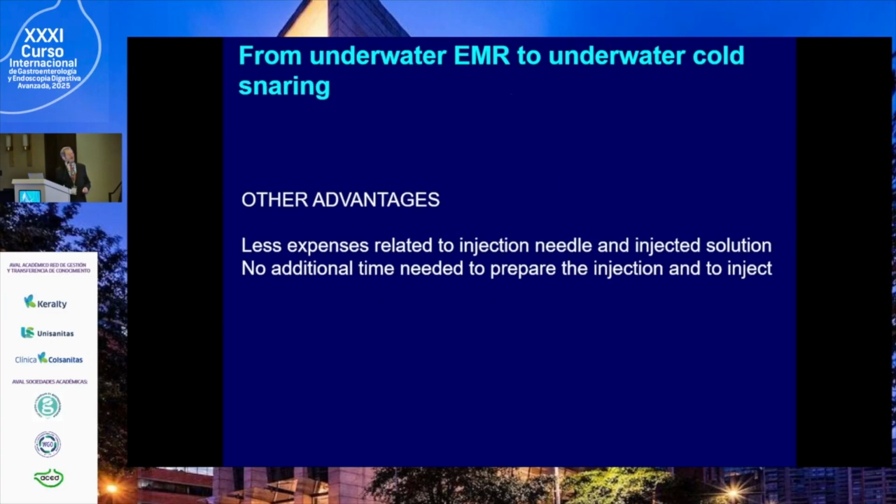Another advantage: less expense related to injection needle and injection solution. No additional time to prepare injection solution. Okay. Is it clear so far? Yes? Okay.